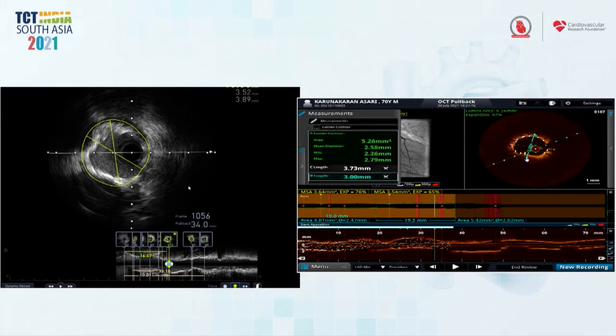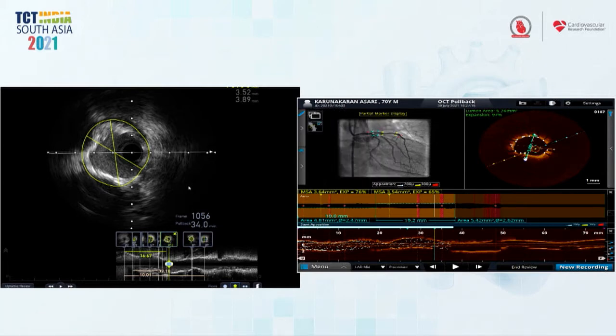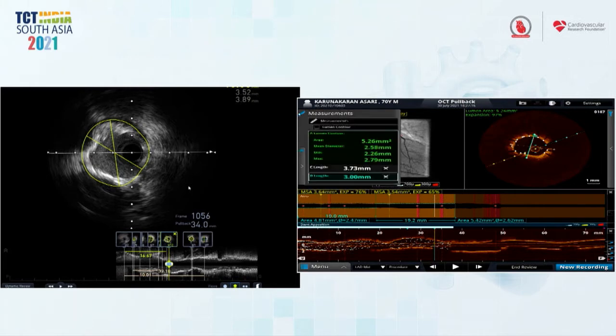Yeah, so that was the point today, to show how various imaging techniques can show various things. And clearly you saw on the IVUS that even conservatively it looks 3.75, so we can safely go with the 3.5 balloon there. And I think I mentioned earlier, 20 atmospheres for a longer period of time. Yeah, we'll do that. Really just let it sit there, which would hopefully help this type of problem.